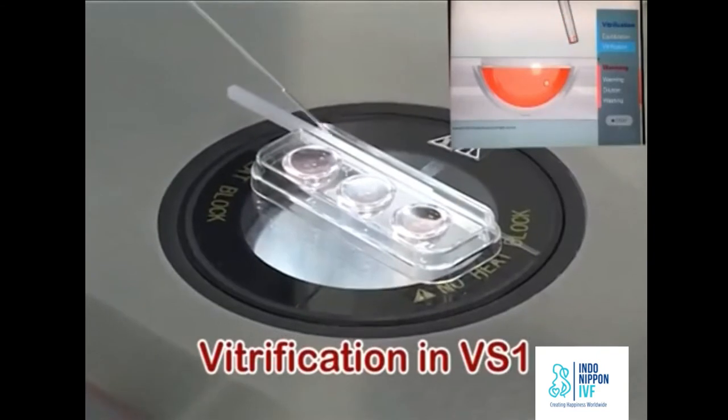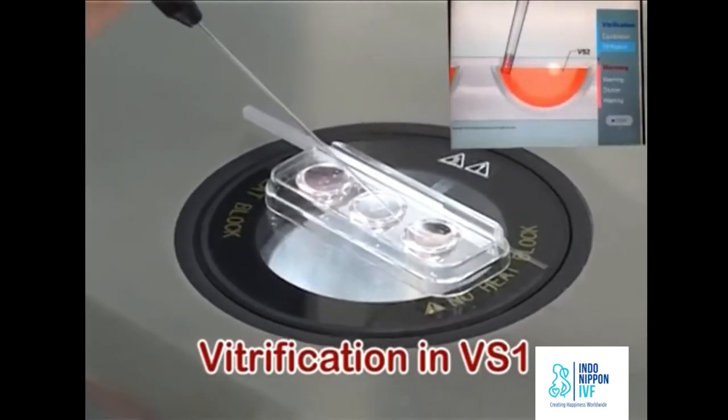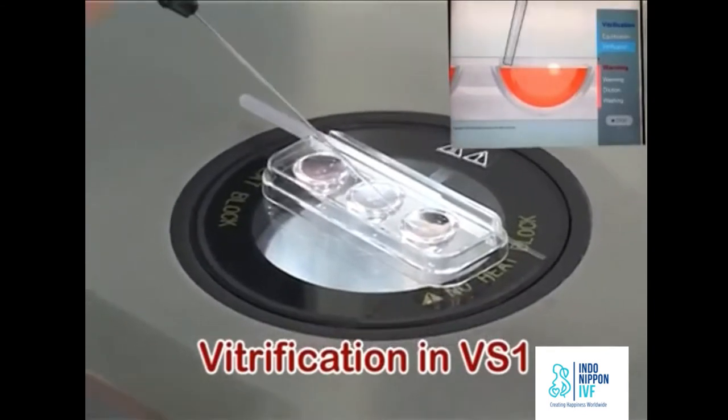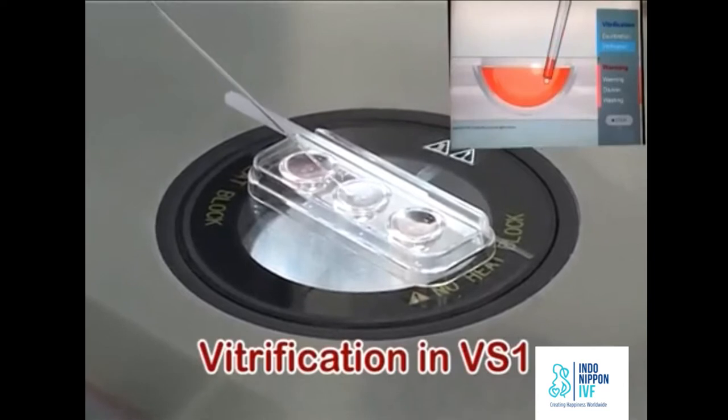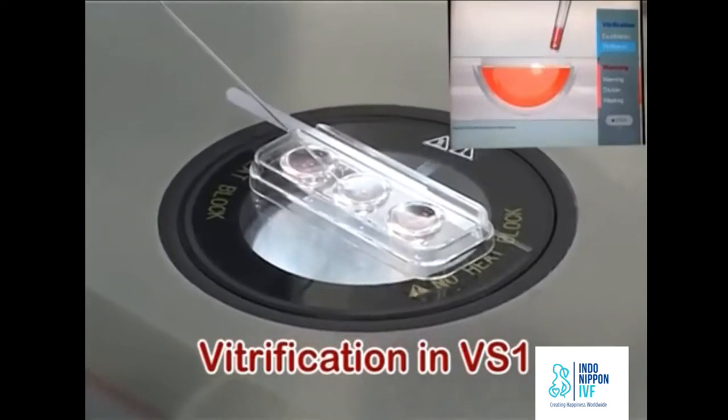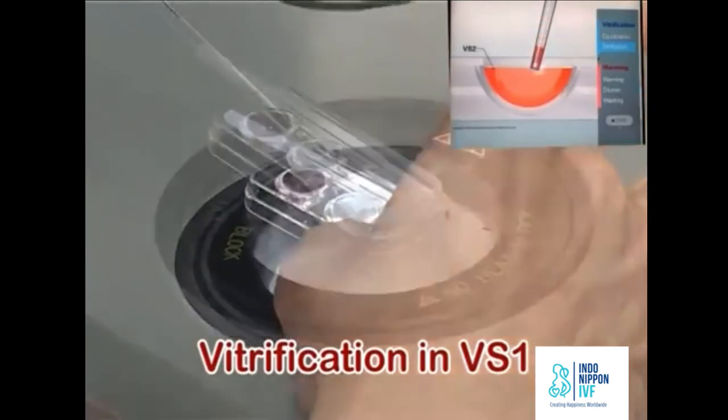Discard the remaining VS-1 and aspirate fresh VS-2. Aspirate oocyte at the tip of the pipette. This entire step in VS-1 should be completed within 30 to 40 seconds.